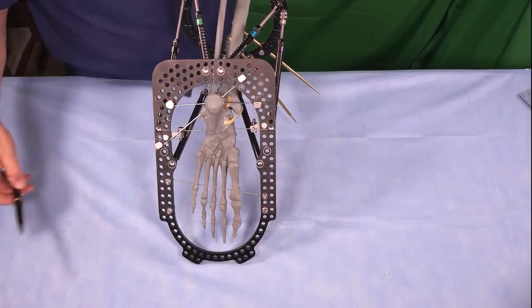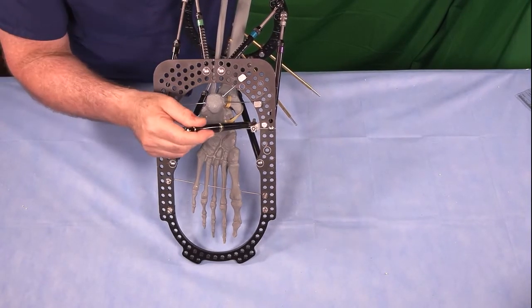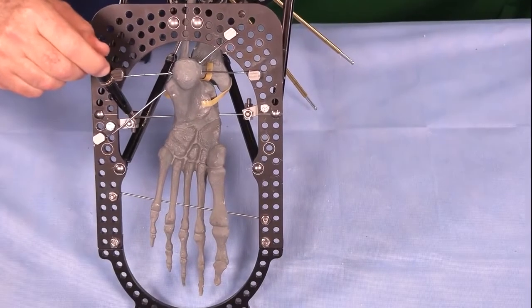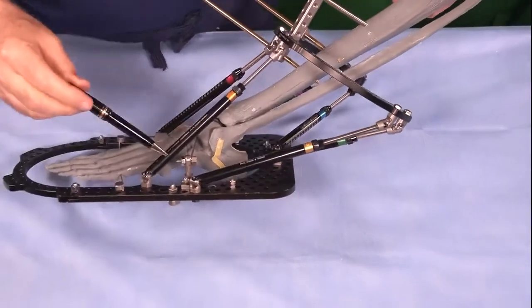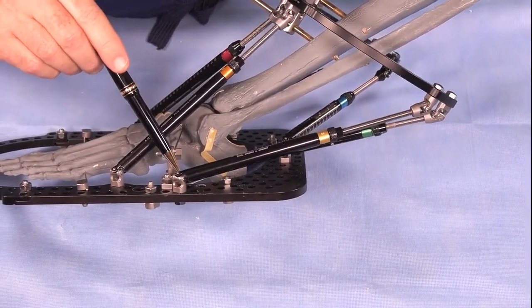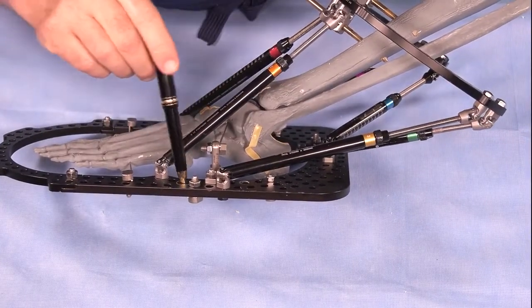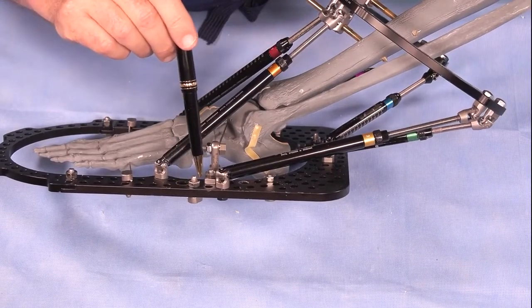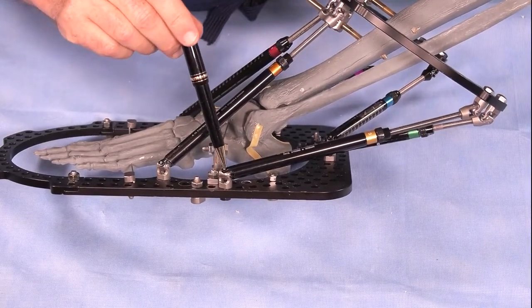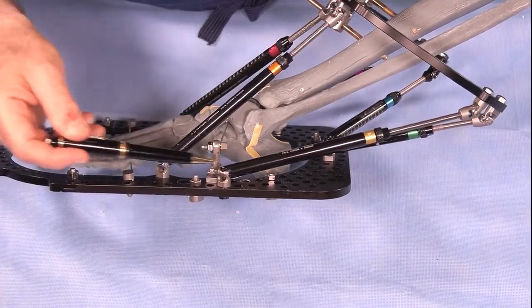If I turn the model over, you can see how I managed to connect the talar neck wire to the ring by dropping these 2 plates inside the ring and then attaching on the inside. It can get quite crowded here, which is another reason why I decided to use the non-standard hole for fixation of this number 3 strut and on the other side the number 6 strut. Normally it would go in this hole, but I pushed it back to the 3rd hole behind, which is a legal hole, and the software will accommodate that as long as you tell it that you did that. And that opens up this space for fixation of a talar neck wire. Very useful for these complex foot deformities.